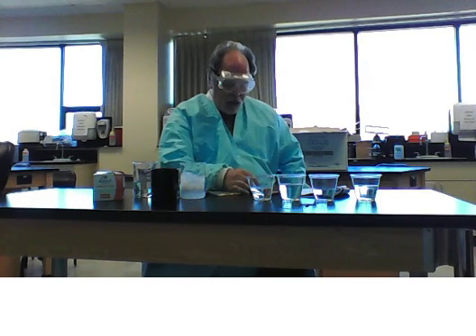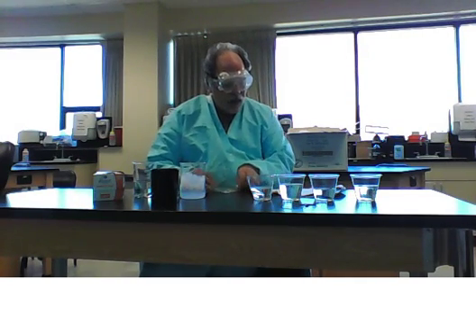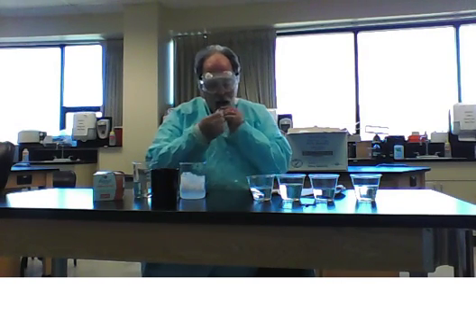Okay? And record that number. Okay? And then turn around and take your temperature. Again, note the initial temperature on the thermometer.